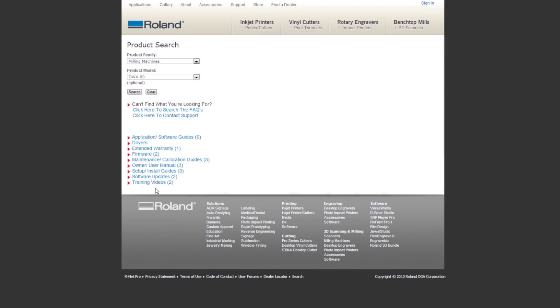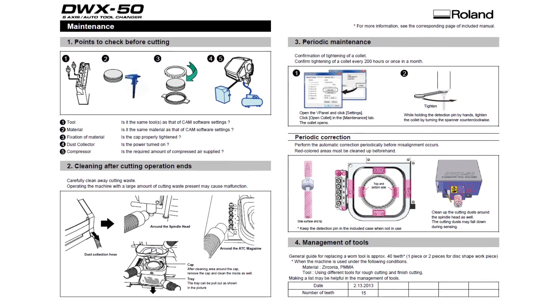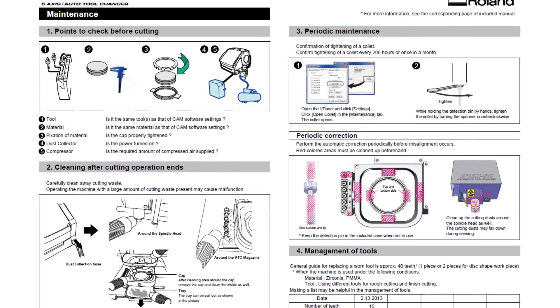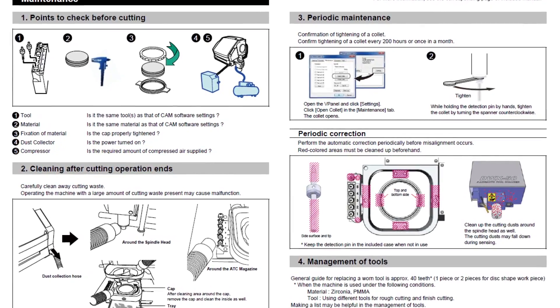Please refer to the supplemental maintenance guide located on the DWX50 support page or in your user's guide included with your machine. Besides the checklist of items to prepare before milling and maintenance of the colette, this document will highlight the areas where special attention should be paid during cleaning prior to calibration.